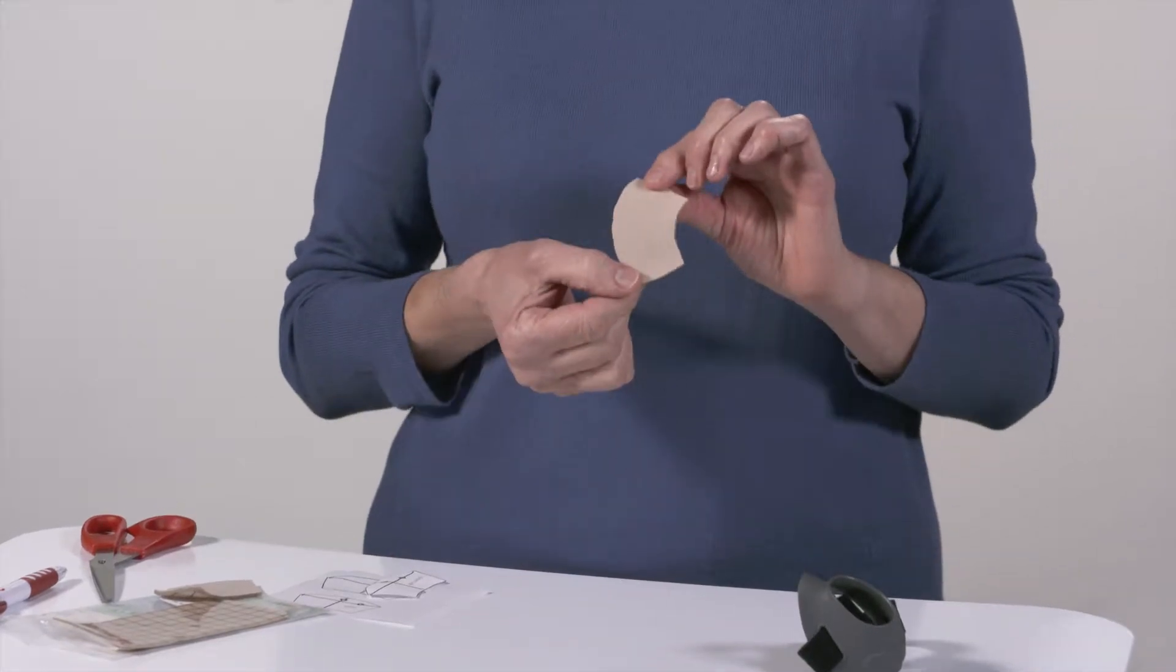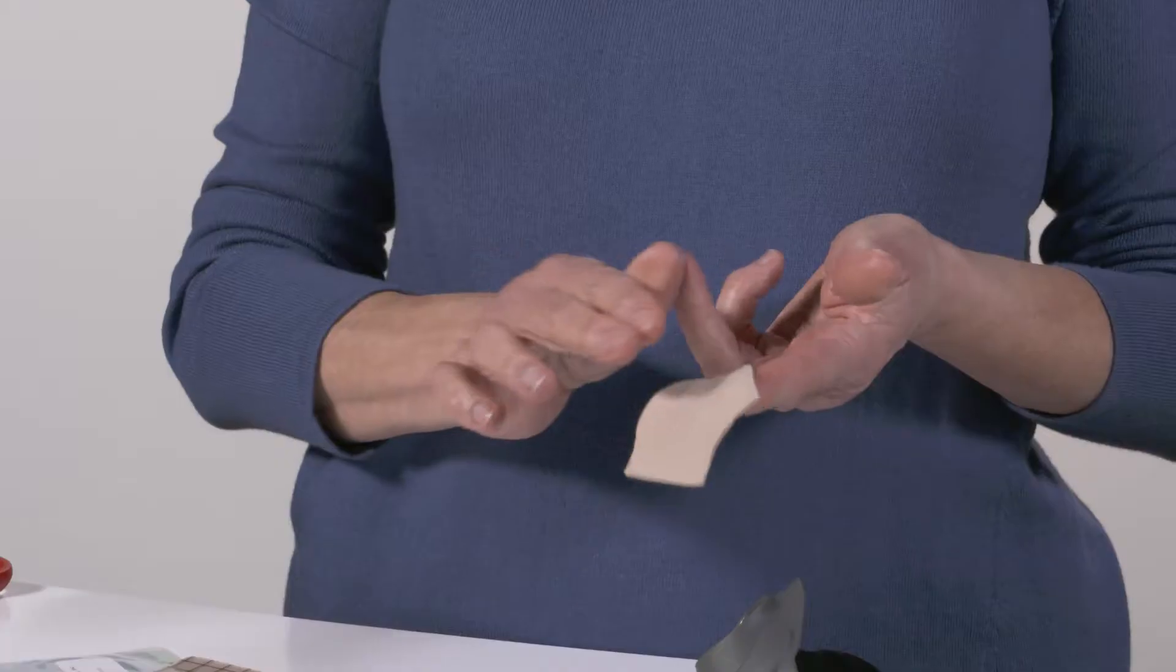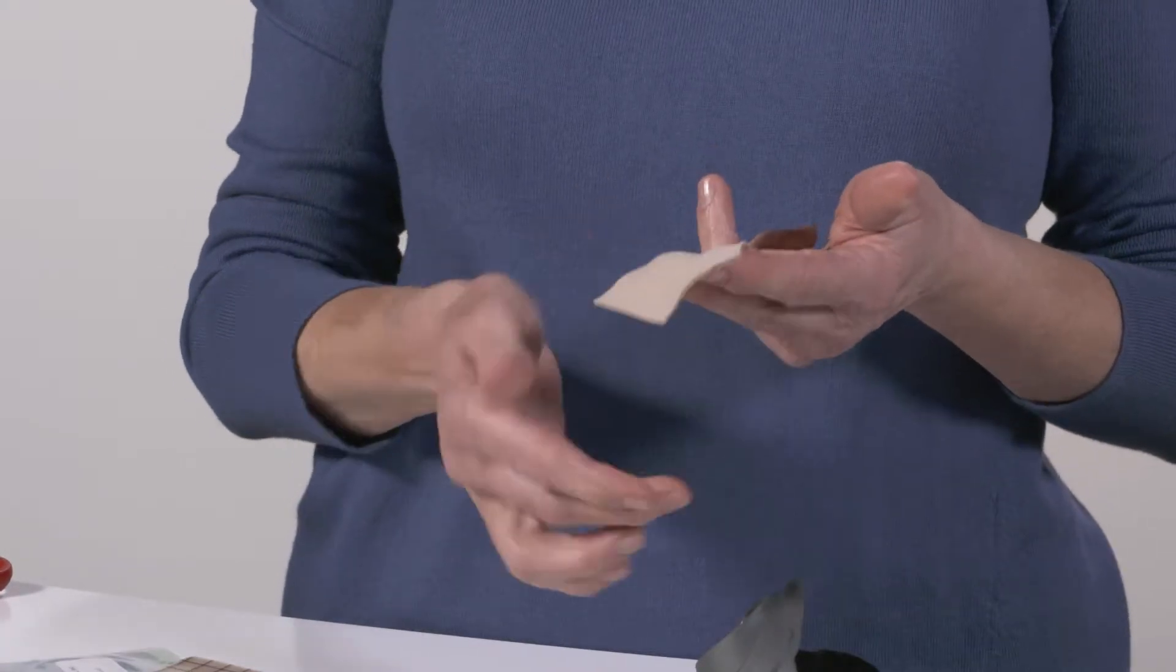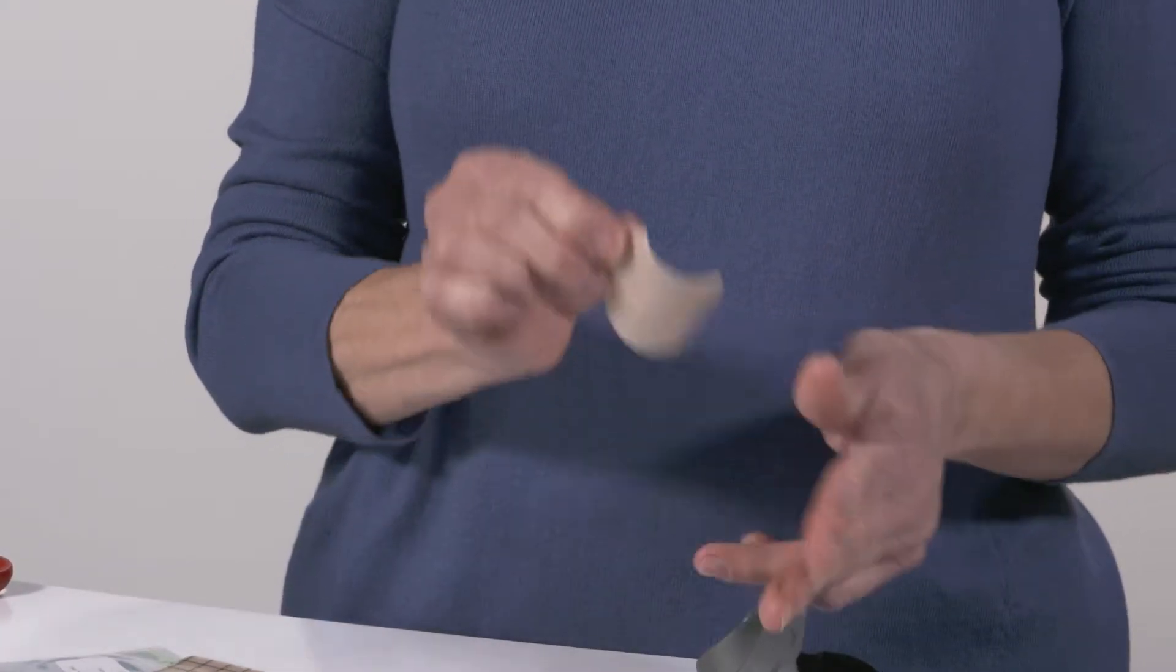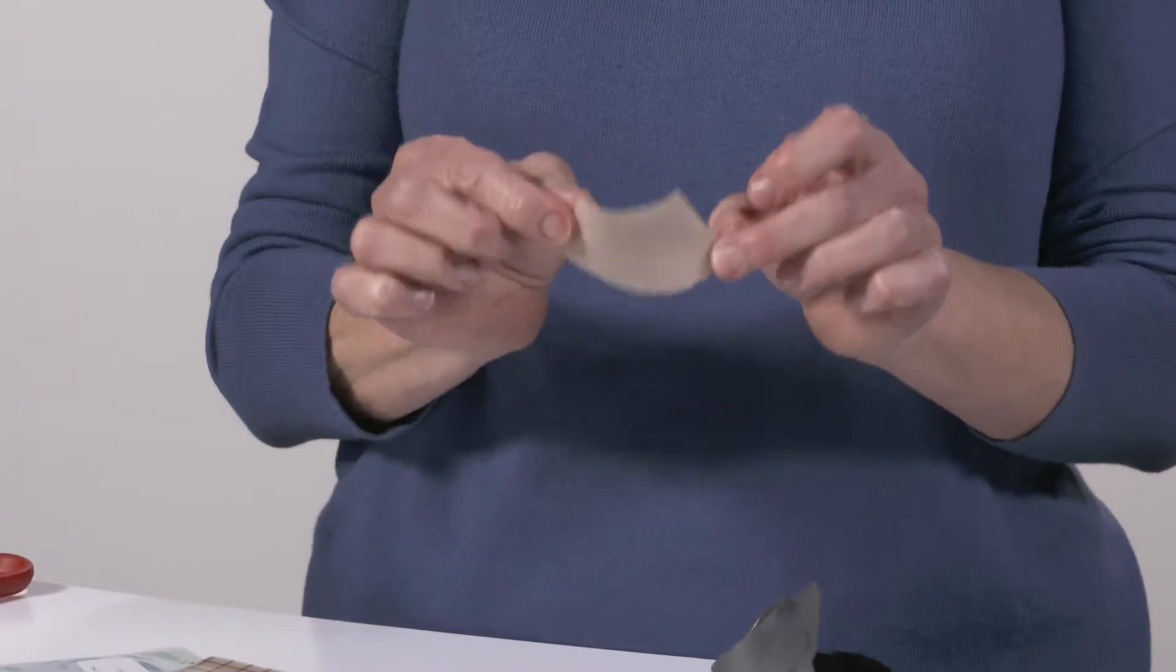GelMate silicone gel has a self-adherent gel on one side and a soft repellent fabric on the other side for a perfectly soft comfortable cushion.